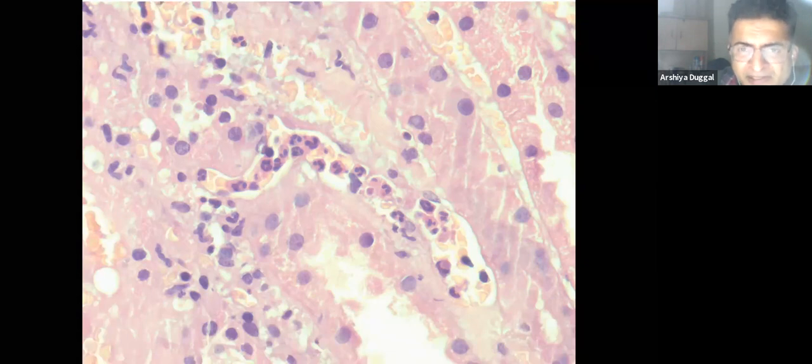So in a conventional transplant, you are going to see microvascular inflammation, that means glomerulitis and neutrophilic peritubular capillaritis. In addition to that, in the tubulointerstitial compartment, you can see acute tubular injury or a very severe kind of acute tubular necrosis. And in the glomerular compartment, as I have shown you, there could be thrombotic microangiopathy also. So these are the classical findings you see in acute AMR.